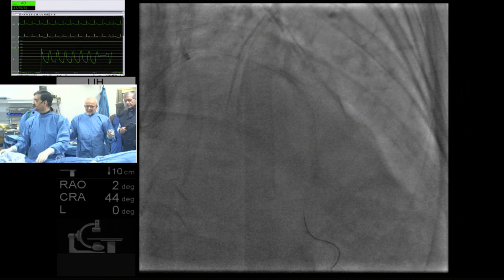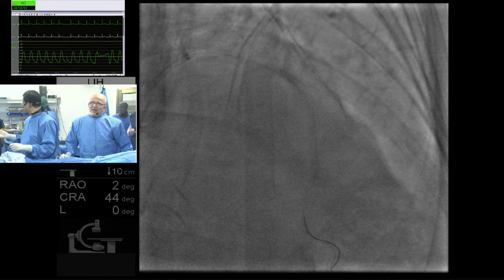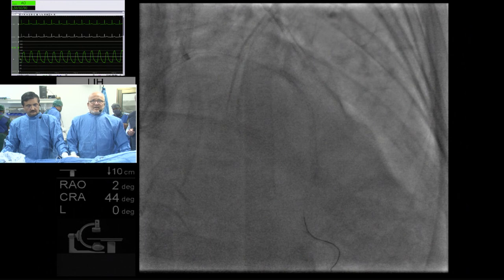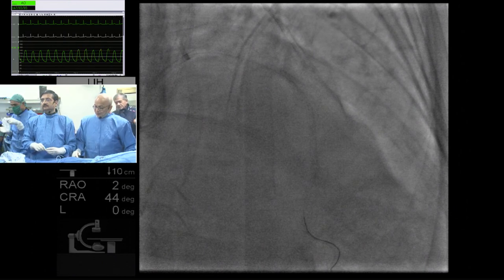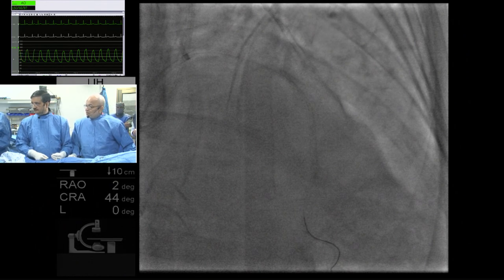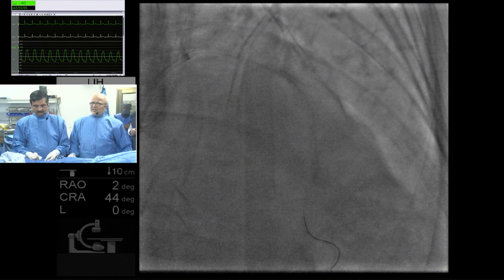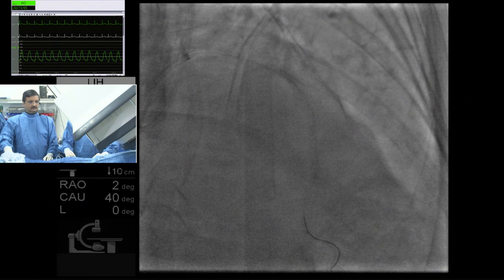We are in the habit of doing angiograms after 1 year in this type of cases and all the left main bifurcations. After using imaging so frequently, I have seen one thing, that things are much better as far as the long-term outcome is concerned. So for a left main, when do you do your routine check angiogram? Not in regular cases, but cases which are very high risk for restenosis or otherwise high risk, like left main bifurcation, left main ostium, right ostium, or some very complicated stuff, or a diffuse disease like this, where we have done multiple stenting.